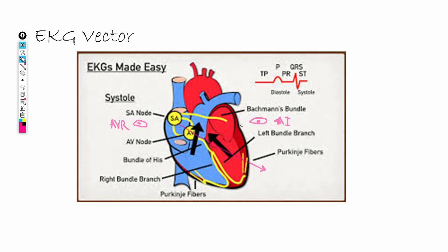Now, keep in mind, both of them see the same thing, but the direction it's moving in is technically different. Let's say the summation vector is moving away from this eyeball while it's moving relatively towards this eyeball. If I were to express this in an EKG strip, it would look like this.